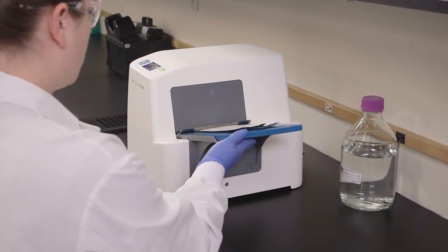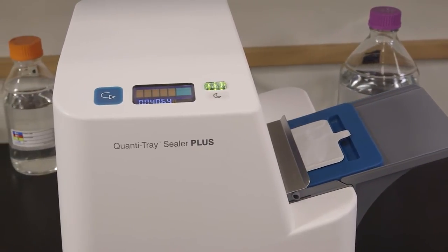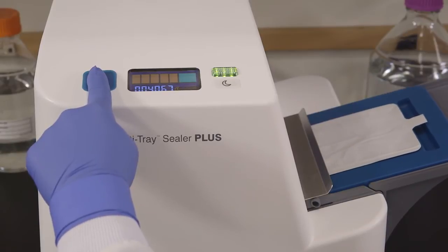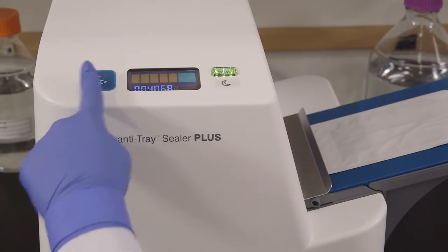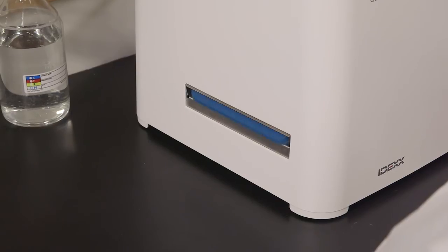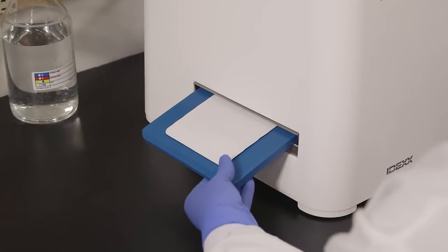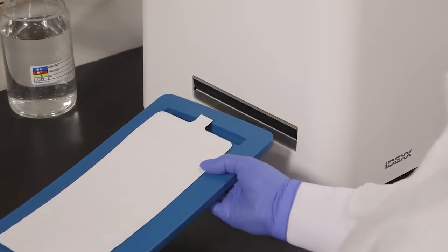Push the insert with the tray into the sealer until the sealer grabs the tray and pulls it into the slot. If you need to reverse the motor, press and hold the reverse button. However, do not reverse the motor if the rubber insert is completely inside the sealer. The sealer distributes the sample mixture into the QuantaTray wells, seals the wells, and partially ejects the sealed tray. Remove the rubber insert and tray from the sealer.